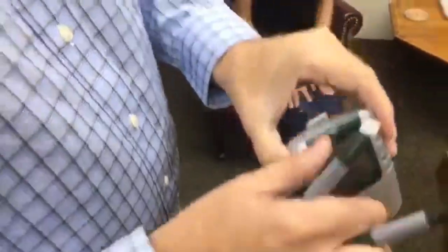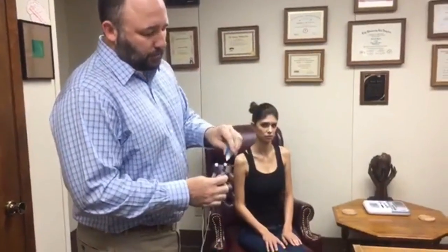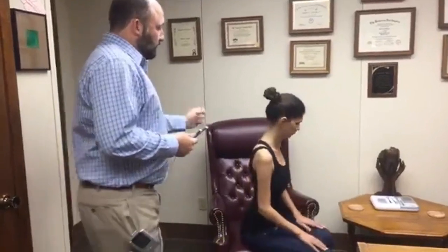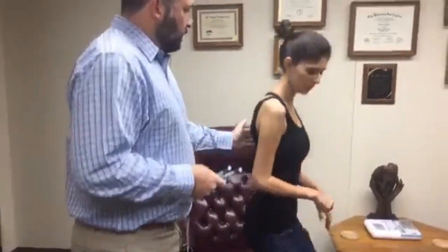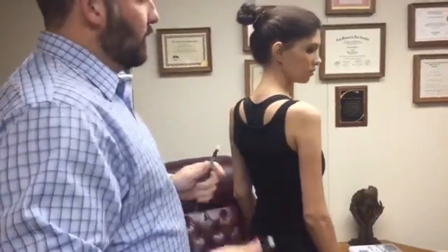So those are our settings. The other really important thing is to wet the probes well with the Alpha-Stim conducting solution — put a few drops on there just to make sure we have good conduction. Rachel is our patient today. She's going to stand up and we're going to show the shoulder protocol, pretending that Rachel's got pain in her right shoulder.